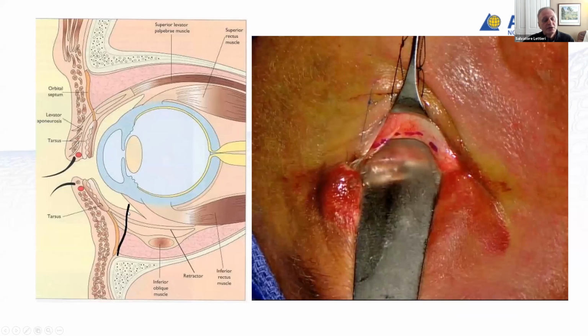I use it for patients that have an isolated orbital floor fracture repair. This is my personal opinion: I do not use it when combining with significant mid-face fractures and other injuries, because it's hard to get the retraction of the lower eyelid to get around to the inferior rim, and there's a tendency for tearing of the lower eyelid and ripping it.